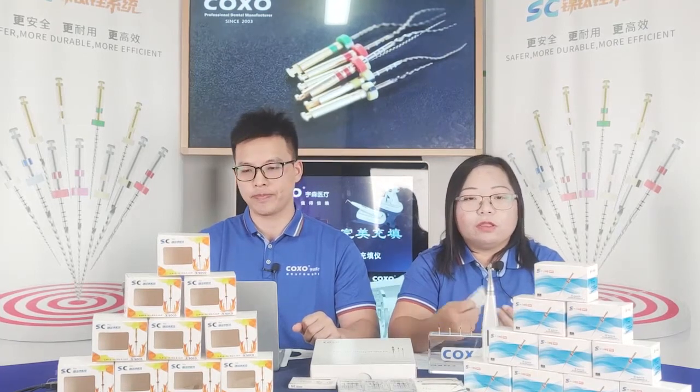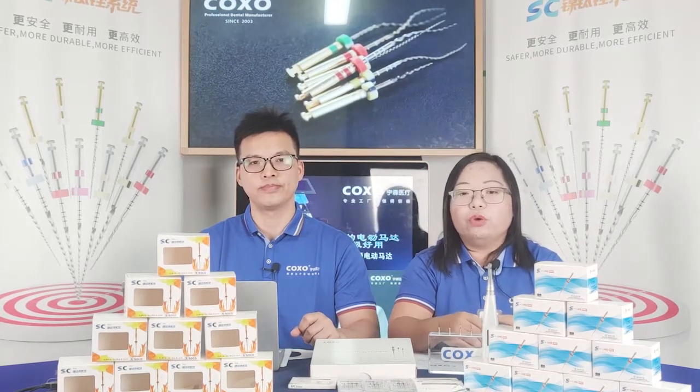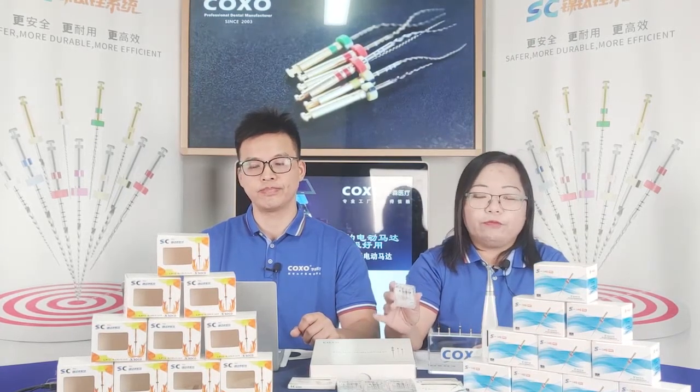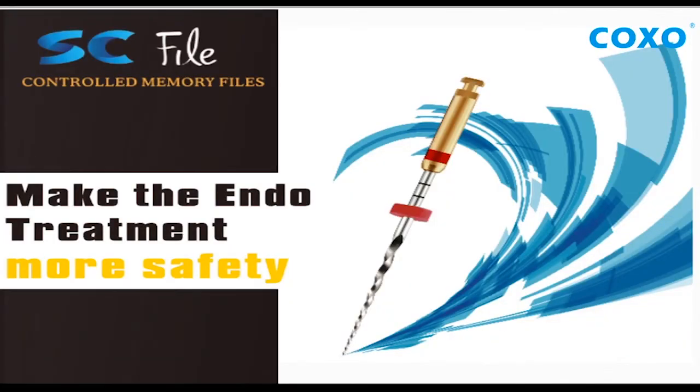Now next, let's change to the PowerPoint to show you the difference between our COXO endofile and other companies. Okay, so now let me use our PowerPoint to show you what is different about our COXO endofile compared with other companies. For COXO, why do we make the endofile? Because we want dentists to use our endo motor and endofile more safely. Yes, safety is the most important for root canal treatment.